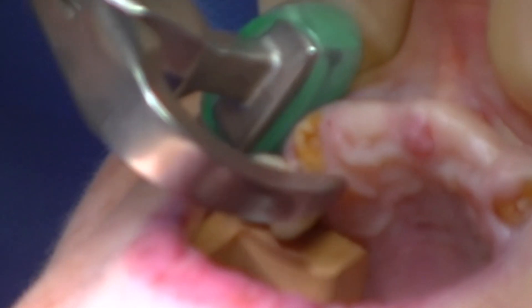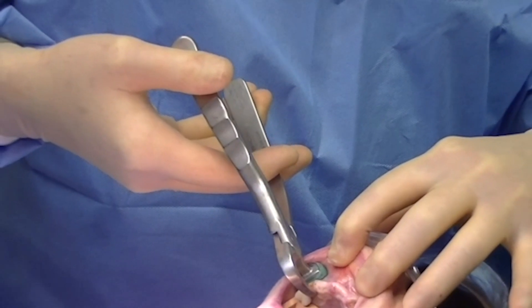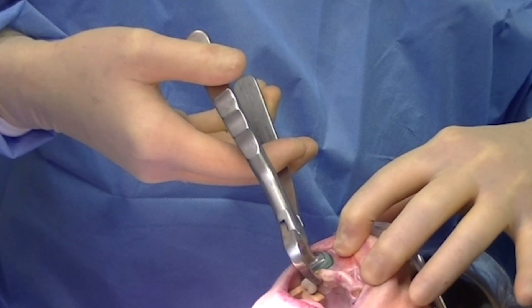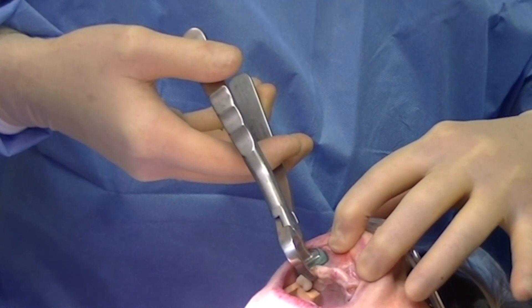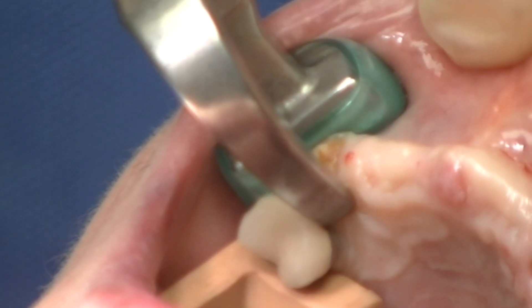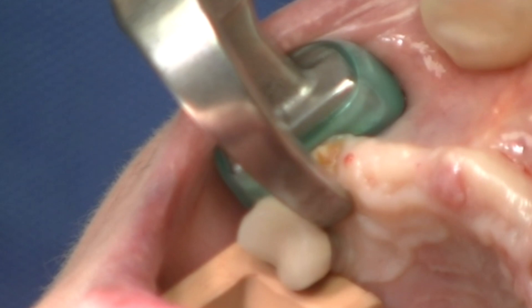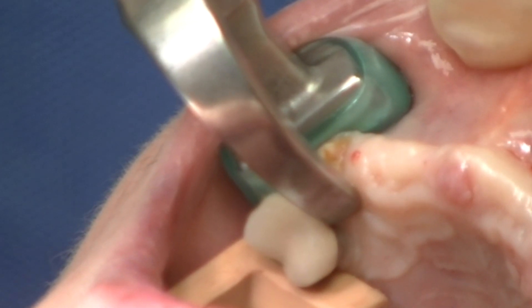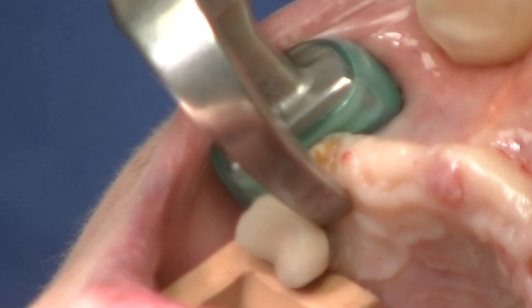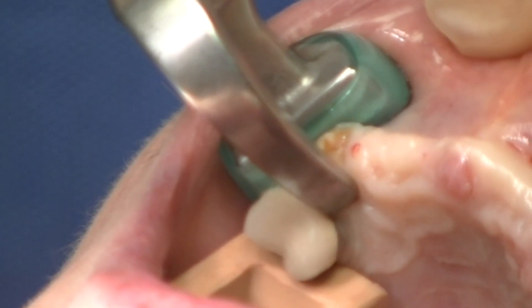The beak will engage the palatal surface of that root, 1-3 mm subgingival. The bumper will be placed as high up the vestibule as possible. And without any force — we're not squeezing the handles, without any hand pressure, forearm, bicep, or shoulder pressure — we will create tension on that palatal aspect of the root. Creating tension will result in a physiologic response and a subsequent breakdown of the periodontal ligament, which will allow the tooth to disengage or luxate up and out of the socket following the arc of rotation of the instrument.